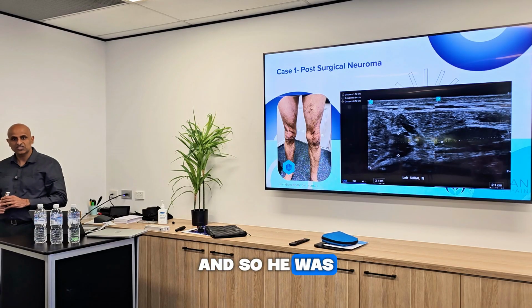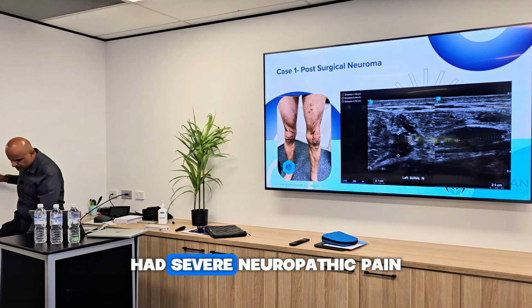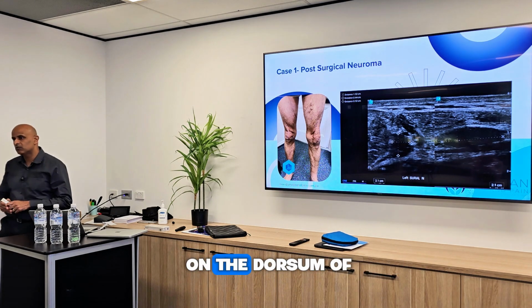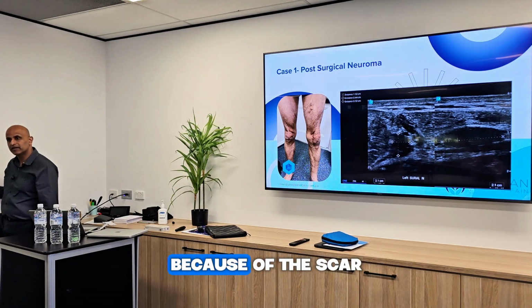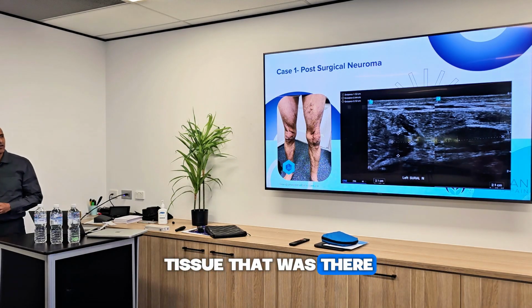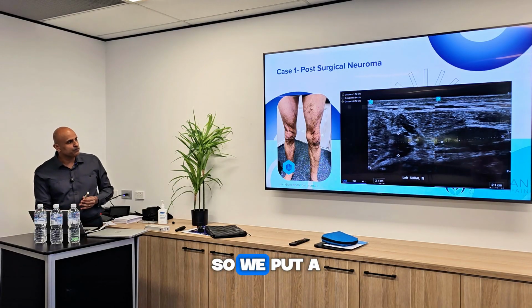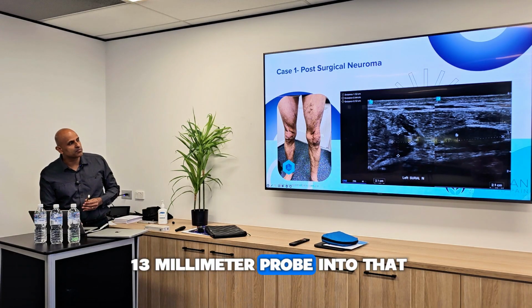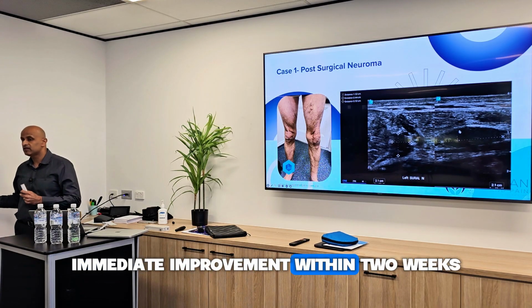And so he was stuck. He could not weight bear on that side, had severe neuropathic pain on the dorsum of his foot, but also couldn't really bend his foot because of the scar tissue that was there. So what we did was cryoneurolysis to that. We put a 13 millimeter probe into that. Immediate improvement within 2 weeks.